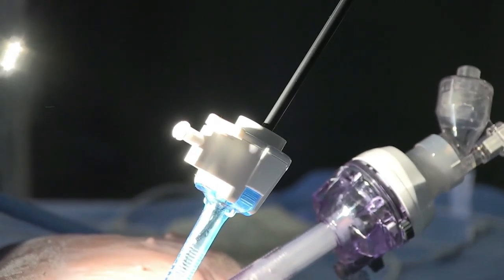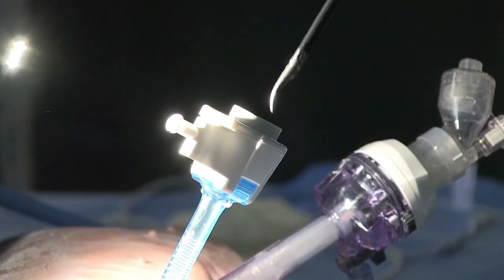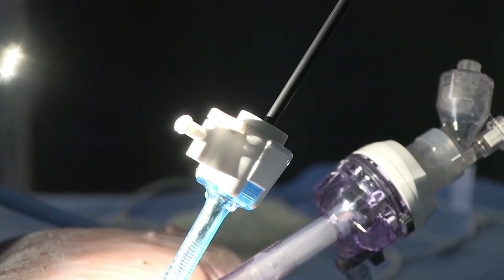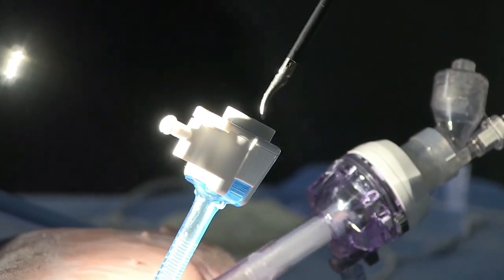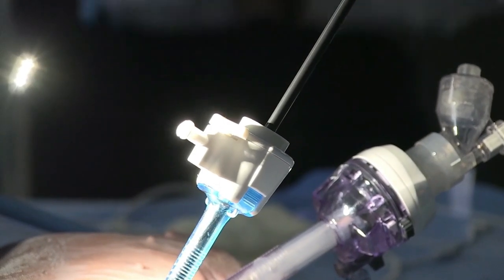Within each instrument exchange, a carbon dioxide jet is released that is capable of carrying droplets and particles into the operating room atmosphere with contamination of both the air and environment.